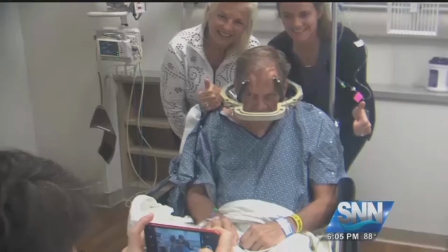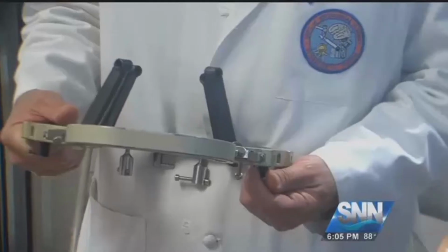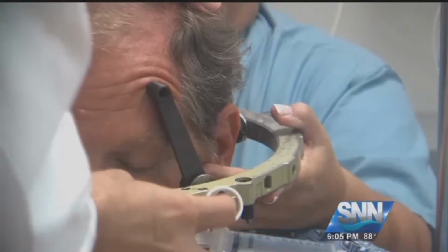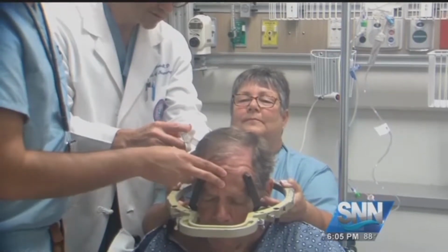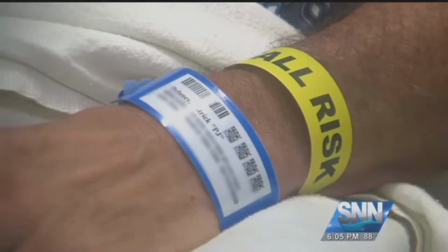That's pretty good. It's an early morning in Gainesville for PJ Delaney and his family. The only painful part of the operation is the numbing medicine that I have to inject in those 4 spots. To best explain DBS, PJ's neurosurgeon, Dr. Kelly Foote, says the brain is a supercomputer. Different wires and circuits in the brain are responsible for things like vision and hearing. And movement. That's why PJ's here.